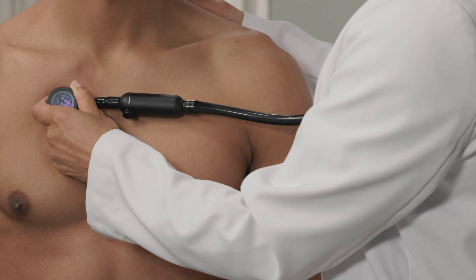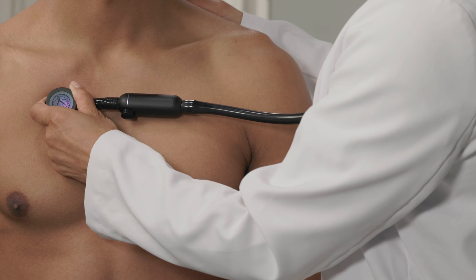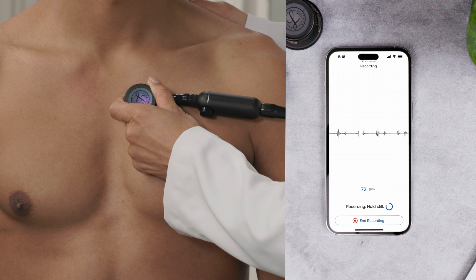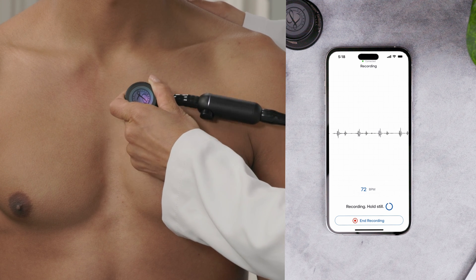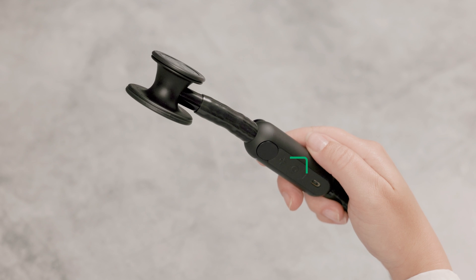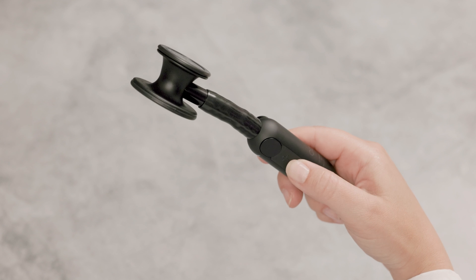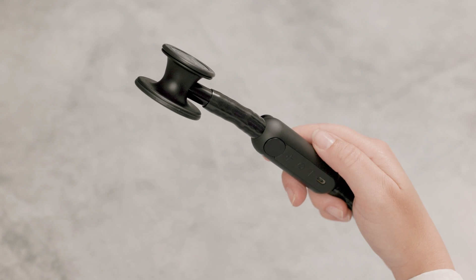Here's a tip: you can also start a recording from the Core and keep your mobile device in your pocket. The device must be actively connected to the Echo app. Firmly press the O button that's between the volume buttons on the Core. You can verify the recording progress in the app if needed.